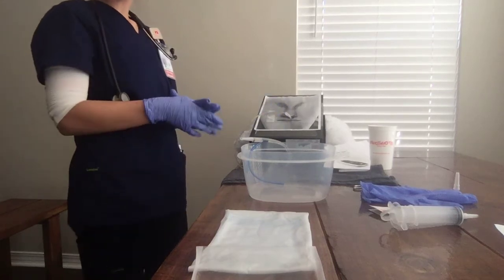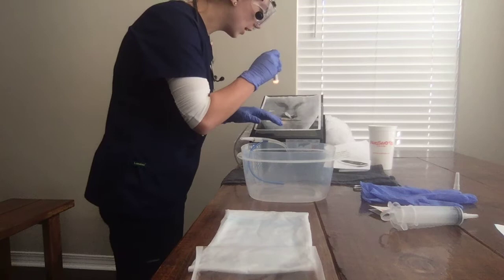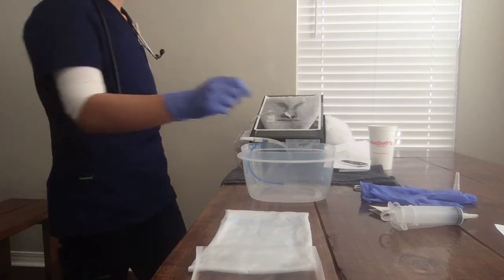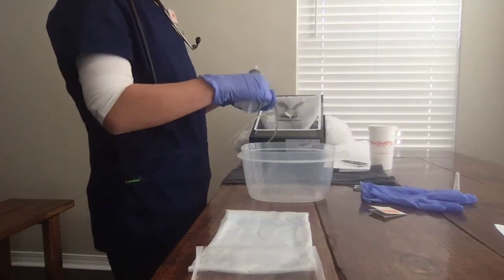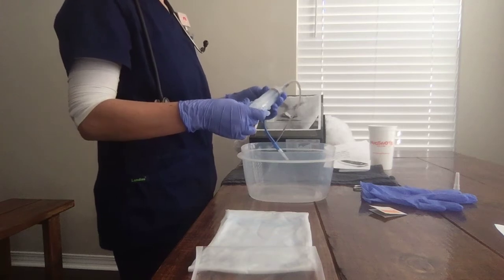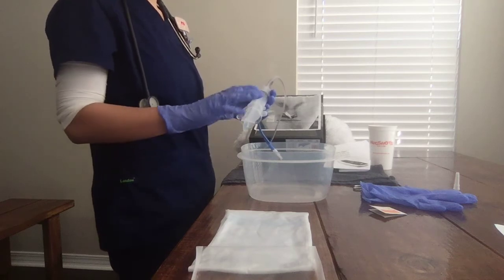And then now I would take a tongue blade and my pen light, and I would look at the back of the throat to check for placement. And then I'm going to take my 60 milliliter syringe, and I'm going to insert and pull back, looking for gastric contents. I would get the pH of those contents, and I would also get an x-ray to verify placement.